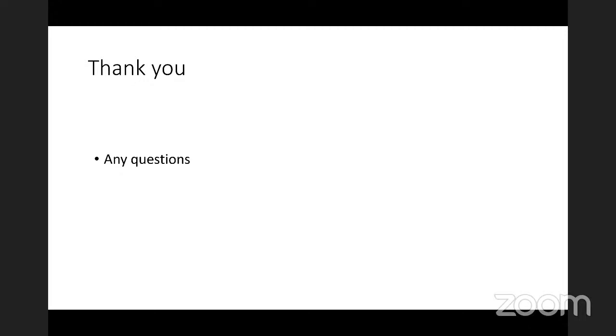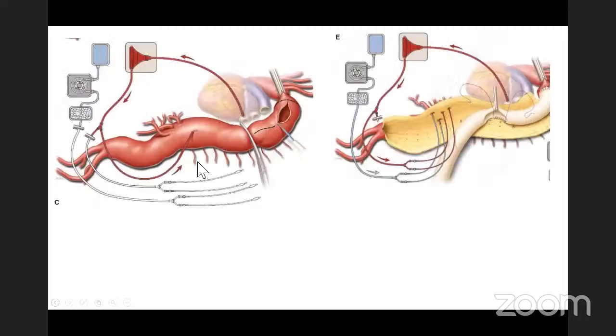And again, when you do these procedures, you also need to perfuse the gut. As you all know, there are big branches: the celiac artery, the SMA, the renals, and those vessels, and you go sequentially. Once you bypass one of them, you just put the cannula in it, a small cannula with retrograde flow. Some people use a small catheter, they call it a Gundry catheter, where you have a balloon, you pass it inside that vessel and you deliver.